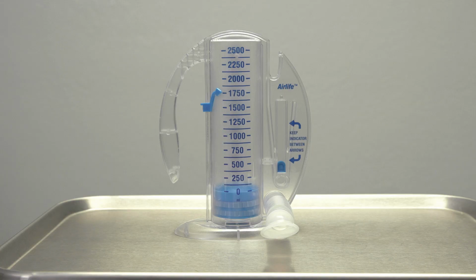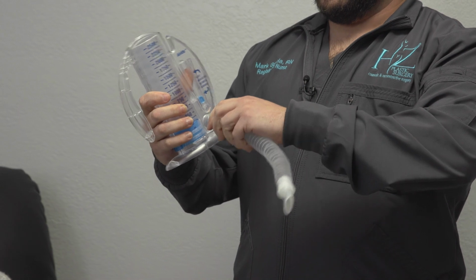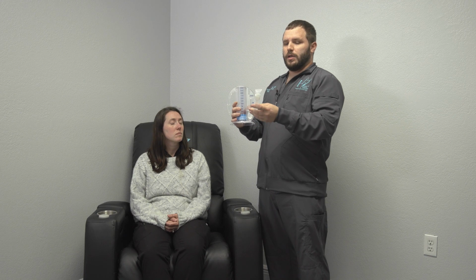When you take it out of the packaging, you're going to have two pieces: the incentive spirometer itself and the mouthpiece and hose. All you're going to do is take the round end and insert it onto the device, and now the device is ready to use. With this device, it's all about breathing in, not exhaling.